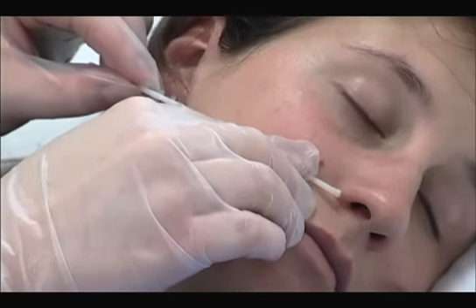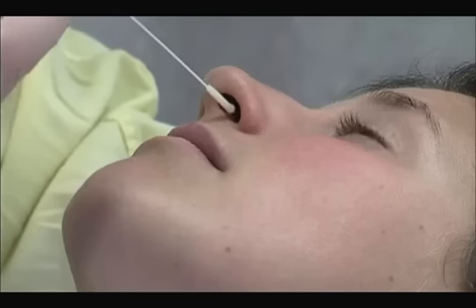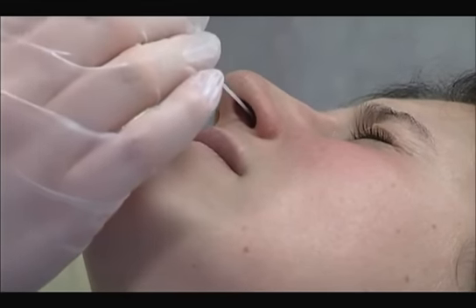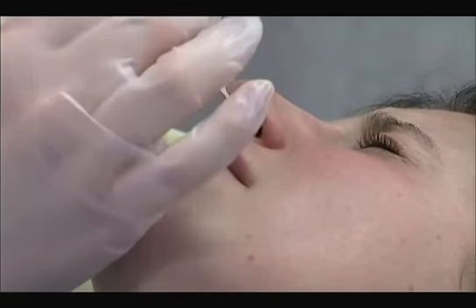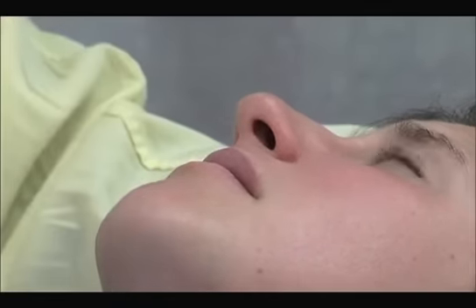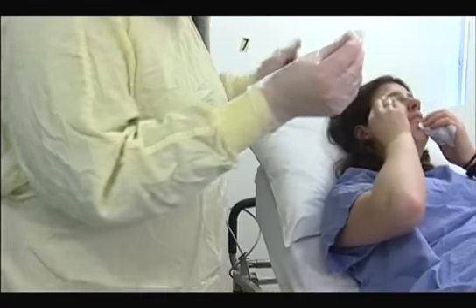Check the distance from the tip of the ear to the nostril and insert the swab to at least half that depth. Insert the swab into the nostril with a few rotations to help collect more cells from the nasopharynx. This process may cause the patient to sneeze or cough.